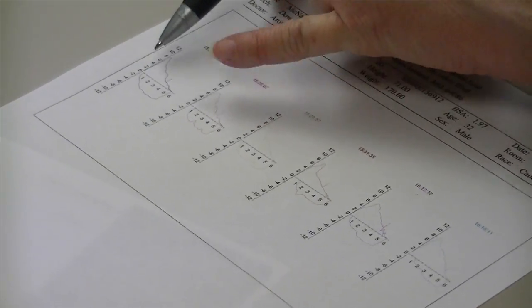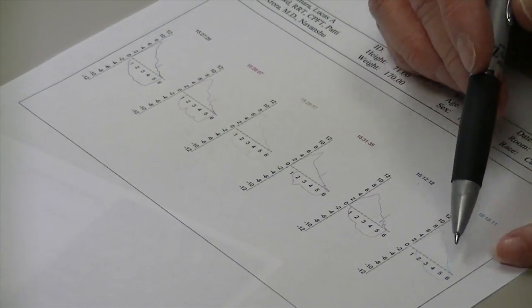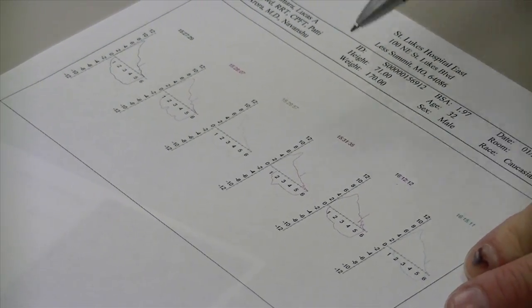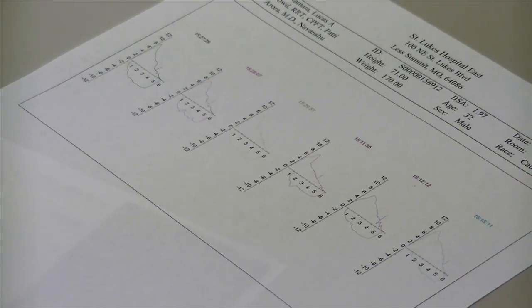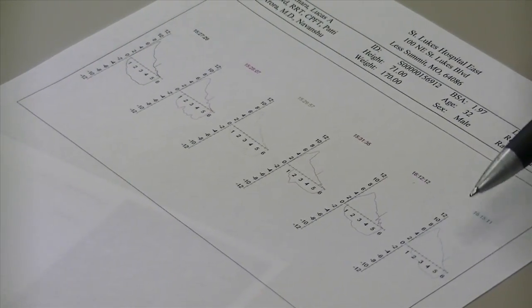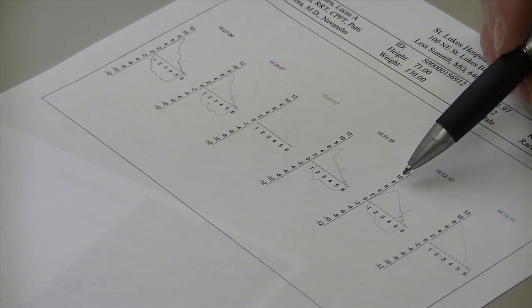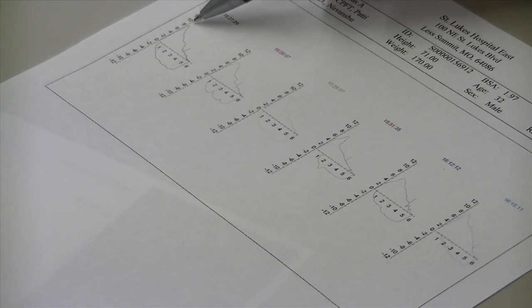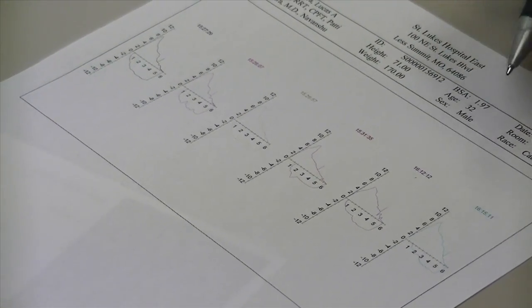It's hard to see in here, but there's a better flow rate, they're saying here. And actually, these look more normal than this. There's a little bit of a concaveness in there where you'd say that's an obstruction. These show a little bit better of an improved flow rate, but I just wanted to see if we could get the same peaks. This one was a nice one, these are all a little bit lower. That last one you did was a nice one.